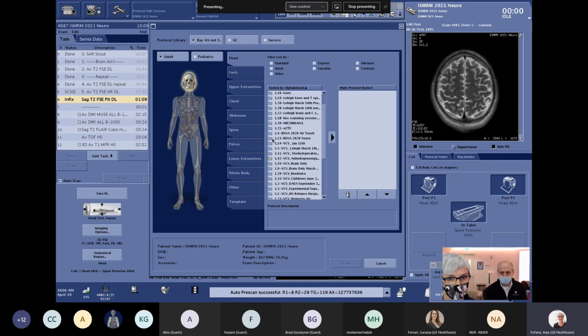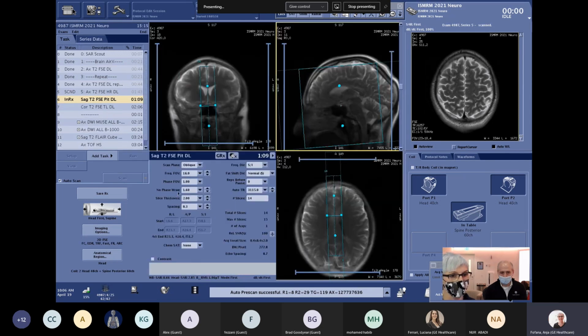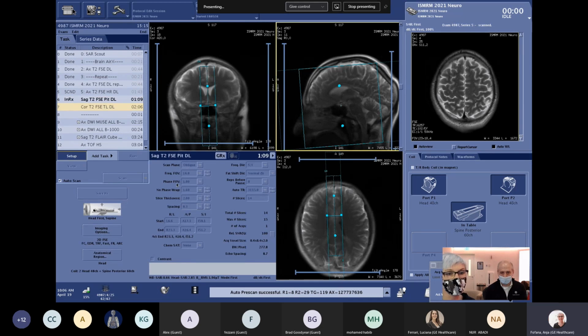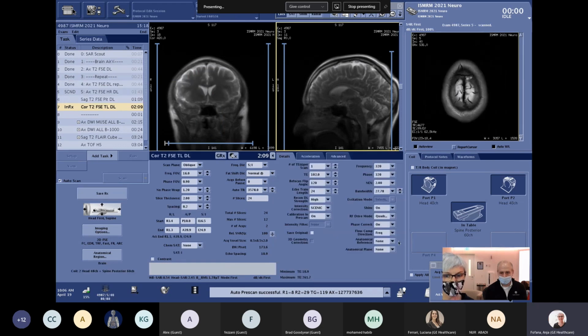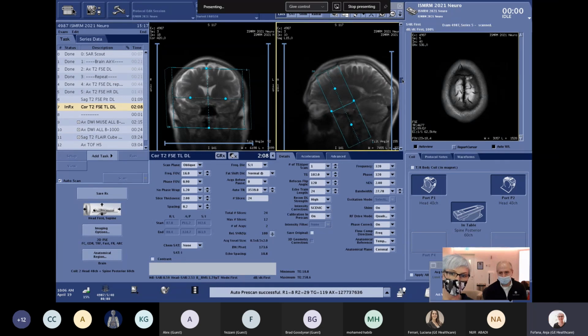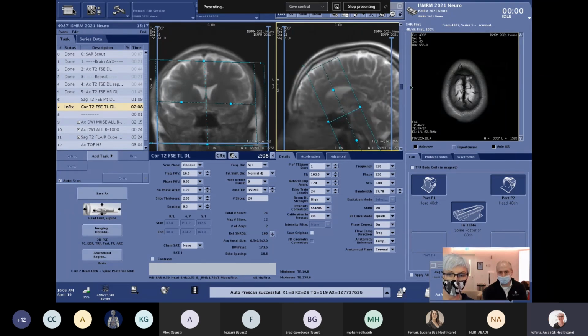Yeah, we just go ahead and I pull that sequence over for the temporal lobe. It's usually done in coronal planes, I would say. So here we see a coronal example. I have to select the brain one more time, and then I will select the temporal lobe. I will select the plane, which is coronal. Then I want to go through the sagittal plane here, the localizer, and maybe zoom in a little bit more so that you can see how precisely the algorithm finds the first slice of the temporal lobe and goes from there. That's great.